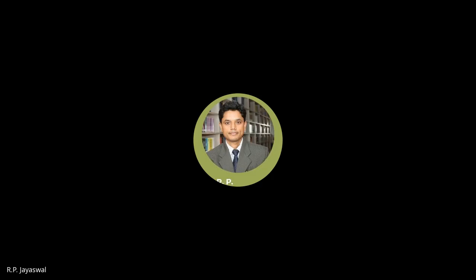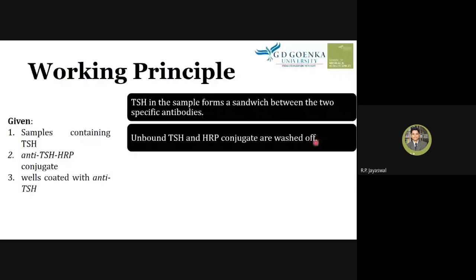After the sandwich formation takes place, we need to wash off the unbound, free TSH and free HRP conjugate.